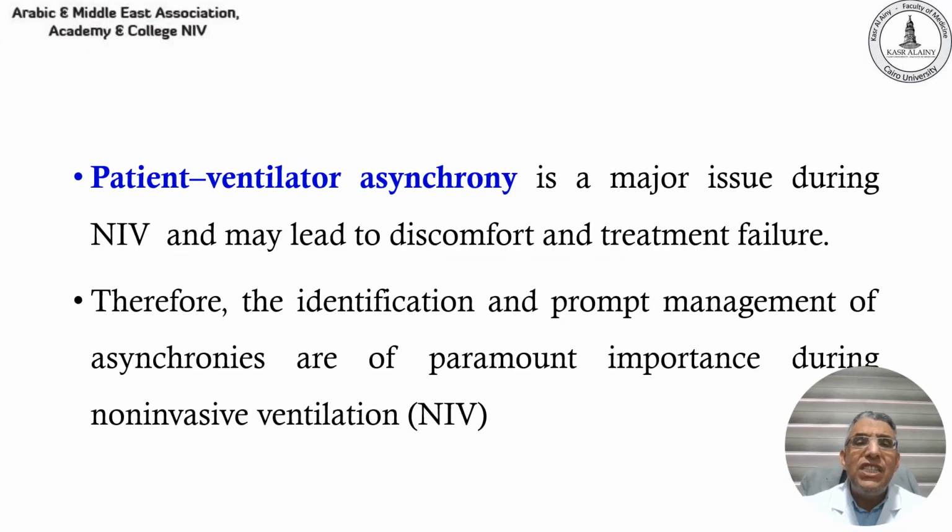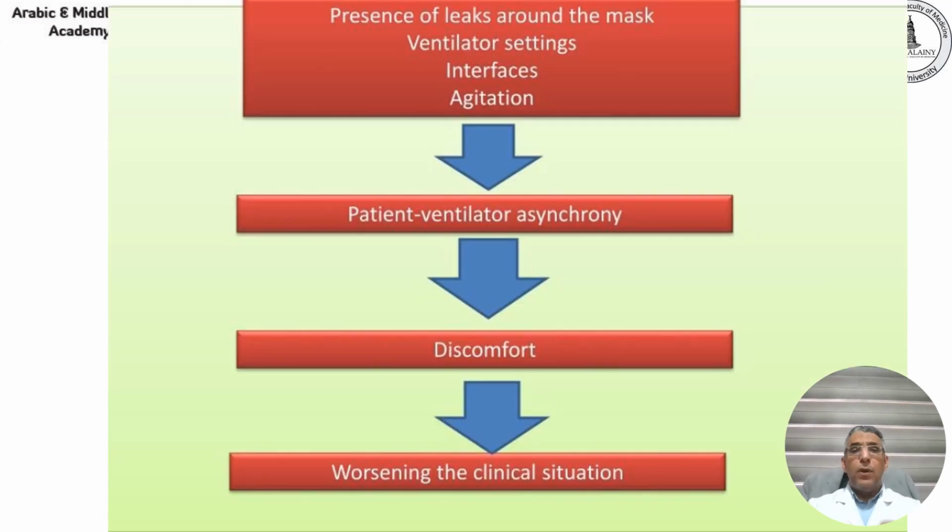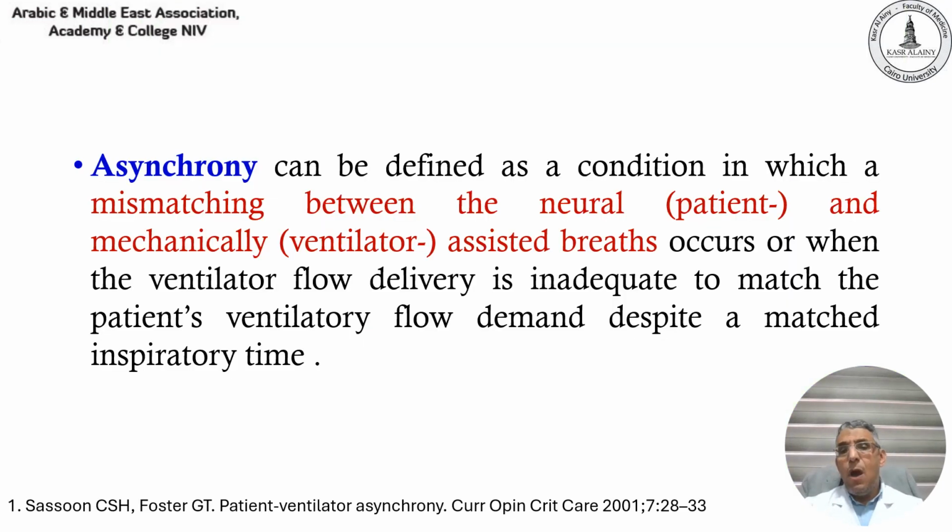Patient-ventilator interaction, or patient-ventilator asynchrony, is a major issue during non-invasive mechanical ventilation and may lead to discomfort and treatment failure. Thus, identification of patient-ventilator asynchrony and prompt management is very important for the success of NIV. Because patient-ventilator asynchrony will lead to discomfort and clinical worsening, the patient may need invasive mechanical ventilation instead of non-invasive mechanical ventilation.